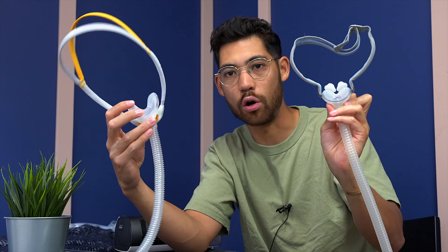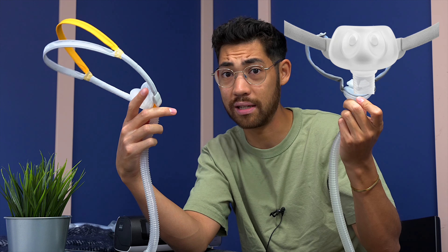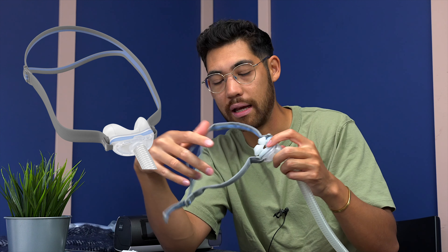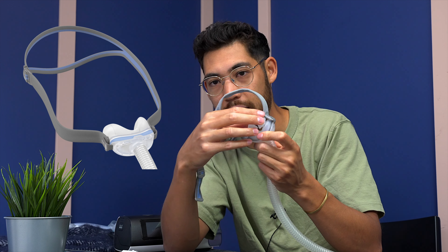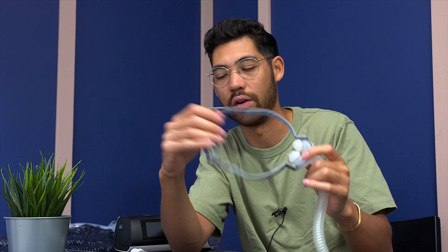Now I know that these masks also have variants. The Solo comes in a pillow version, which is going to be slightly closer to the P10. And the P10 comes in a similar variant — the N30 — which is very similar to the P10, but it has a cradle instead of pillows. Because the P10 is much more popular, I just made this video. If you want a cradle, just pretend I'm talking about the N30 rather than the P10, because the rest of it is very, very similar.